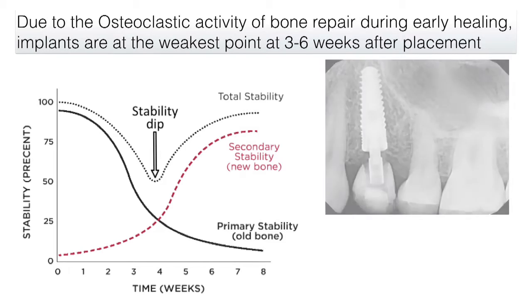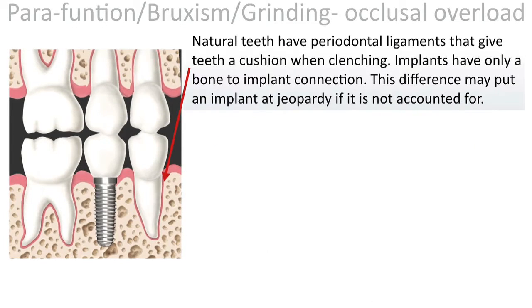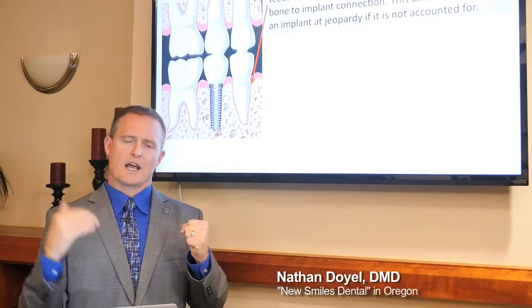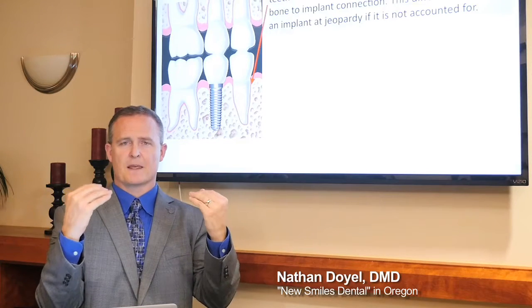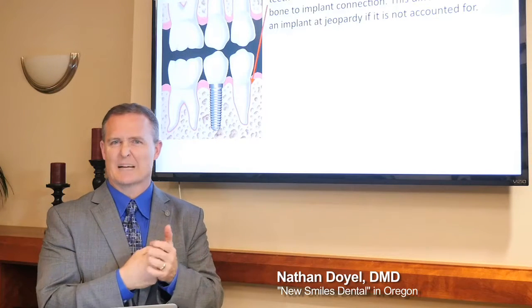So you've got to be careful when you're having an implant to make sure it's out of occlusion. If you're going to do an immediate and have a temporary that's available for someone to chew on, they've got to be compliant, and you've got to have it far out of occlusion. Because what happens is the adjacent teeth have periodontal ligaments. They can actually absorb some of the forces. Your implant can't do that, because it's in bone. As the periodontal ligaments of the adjacent teeth cushion, it allows that tooth to get in contact that wouldn't otherwise be in contact, especially if they're bruxers clenching their teeth at nighttime.